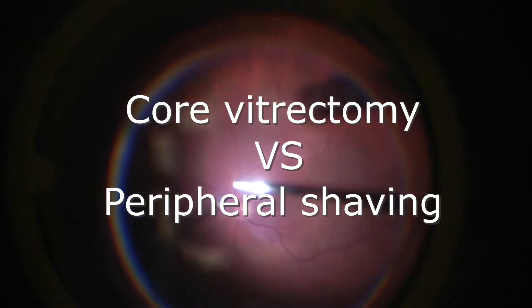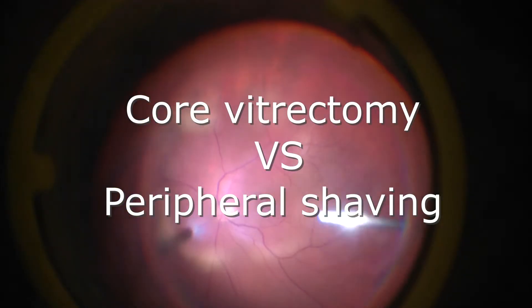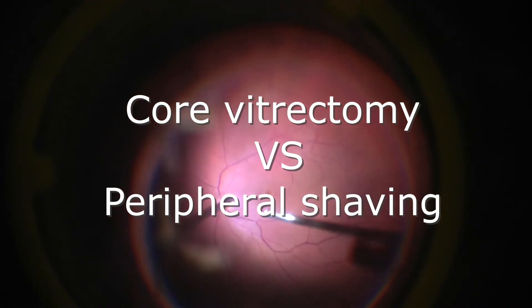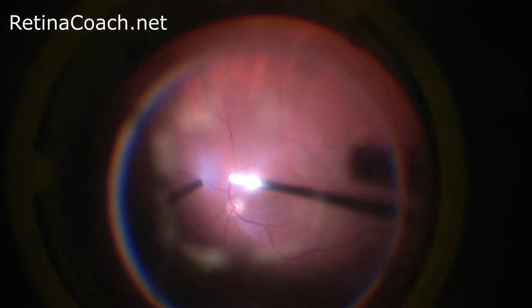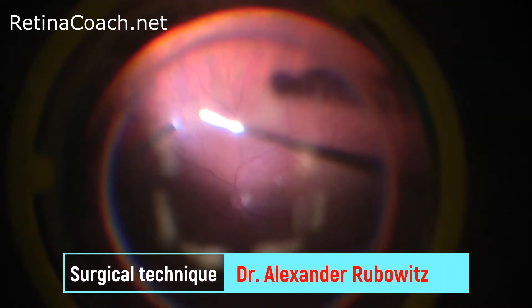This is Anfisa from RetinaCoach. Today I will talk about Core Vitrectomy and Peripheral Vitreous Shaving. The idea of Core Vitrectomy is to remove a central part of the vitreous.